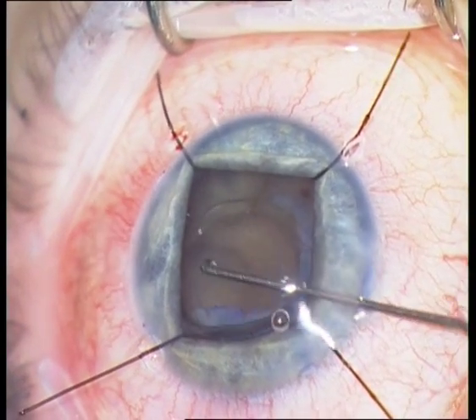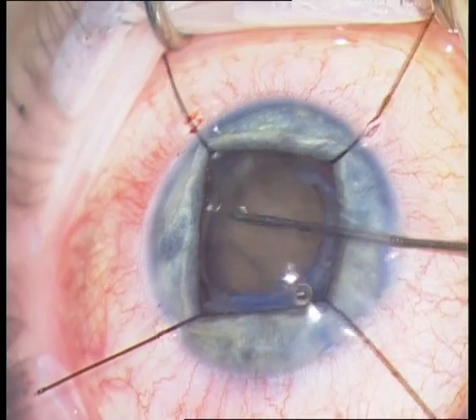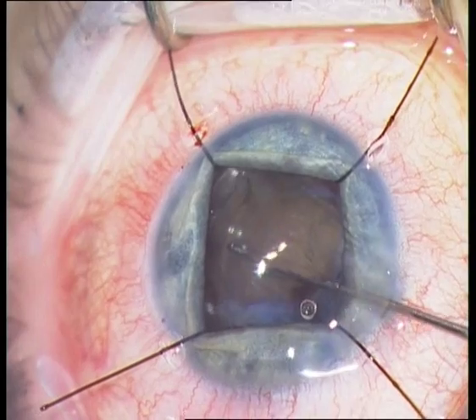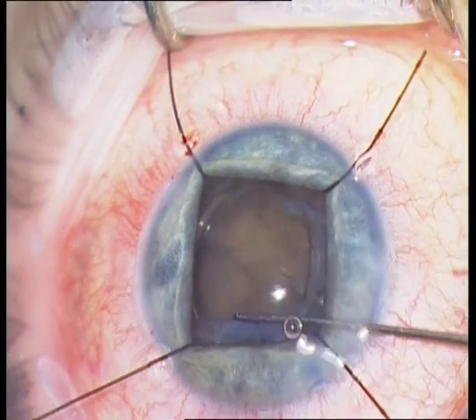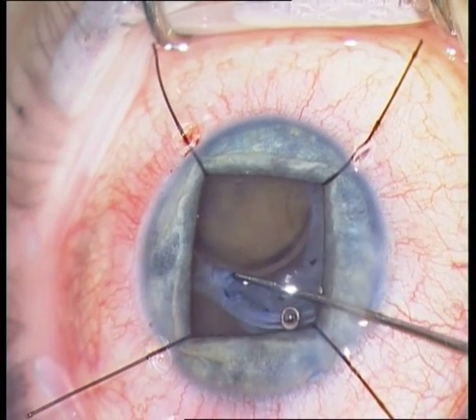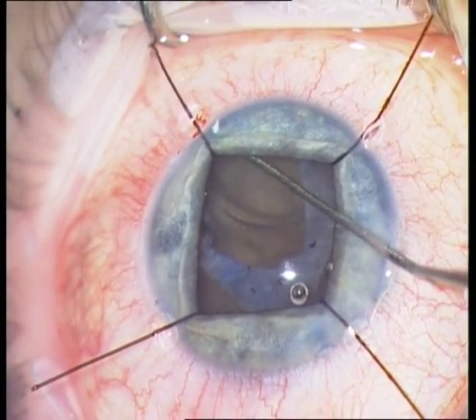The final step is the implantation of a one-piece IOL. You can see that this push-pull instrument is very useful for manipulation of the IOL, because you can also rotate the haptic with the push-pull.